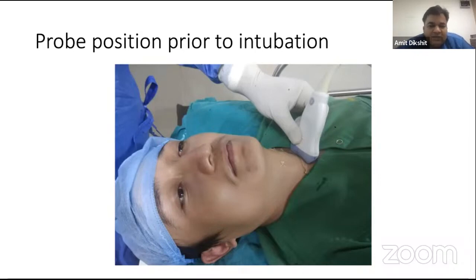So when both are seen in one view, it gives me peace of mind, because most of the time when my PGs and fellows are intubating, I really want to know where the tube has gone. Most of the time the junior most PG will almost go into meditation, with nothing to speak, and we are so worried about what is happening, where is the tube, and they will not tell anything. So it really increases the anxiety.